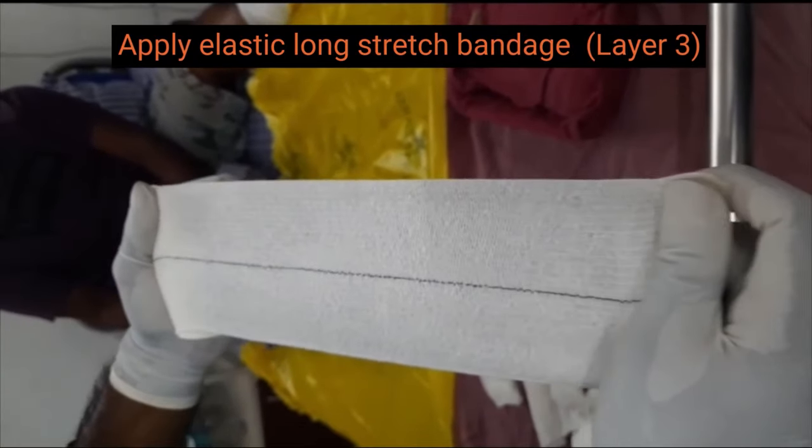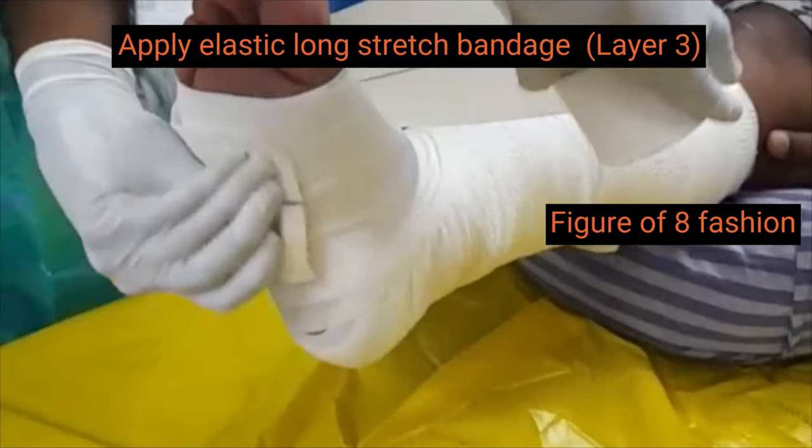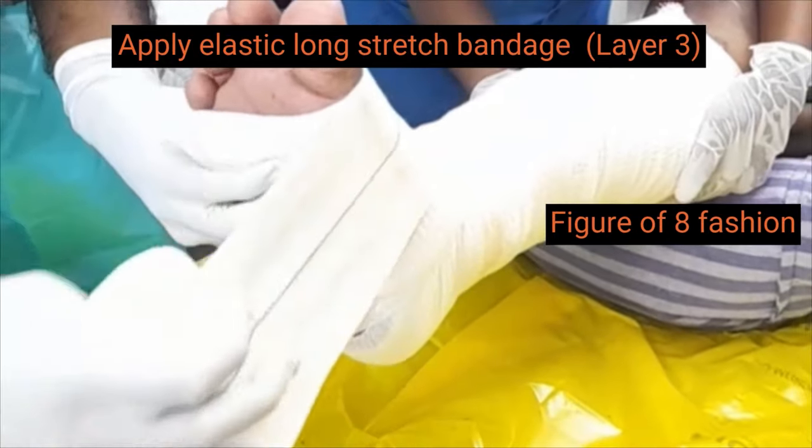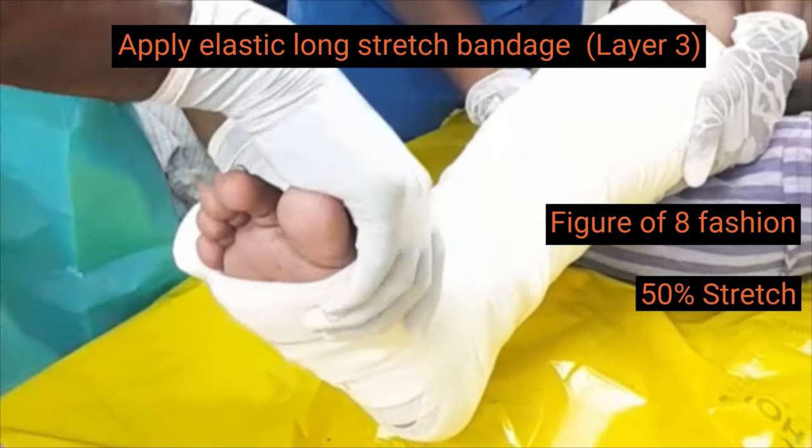The third layer, the elastic compression bandage, has a line at the center to guide the amount of overlap. The bandage is stretched at just more than 50% between no stretch and full stretch and is applied.